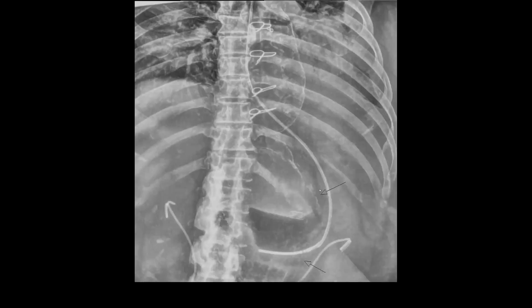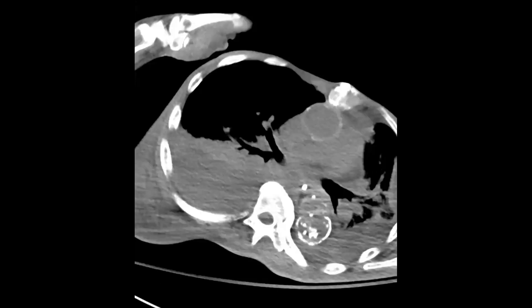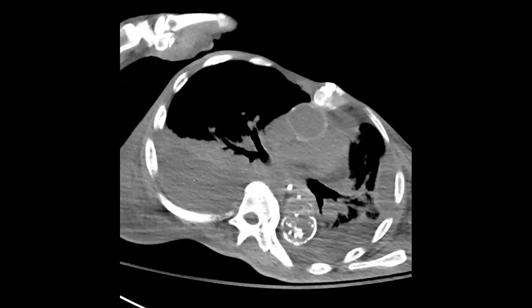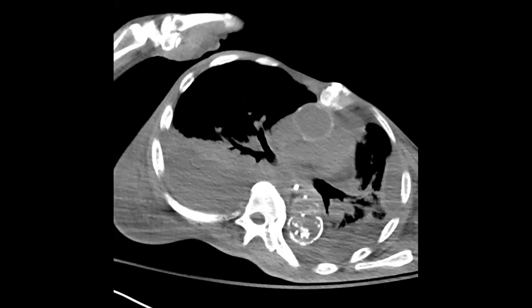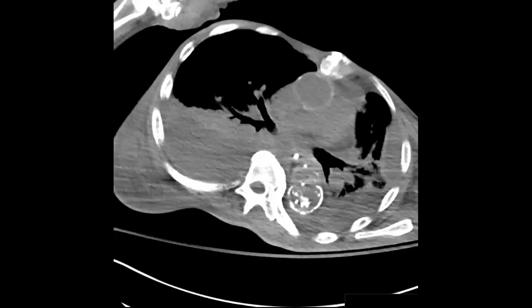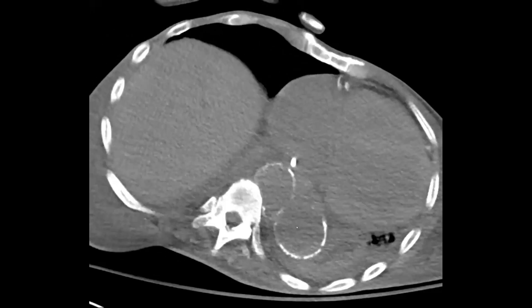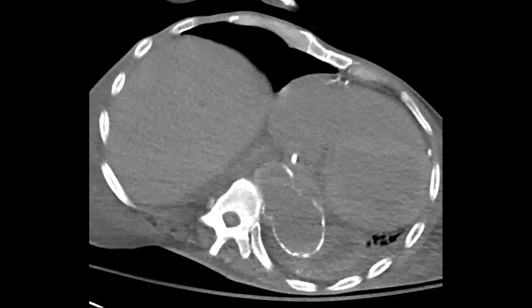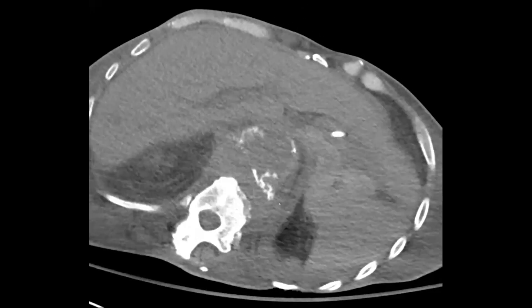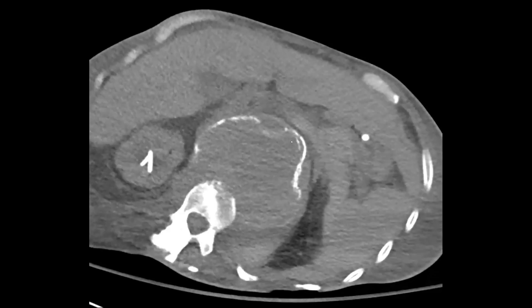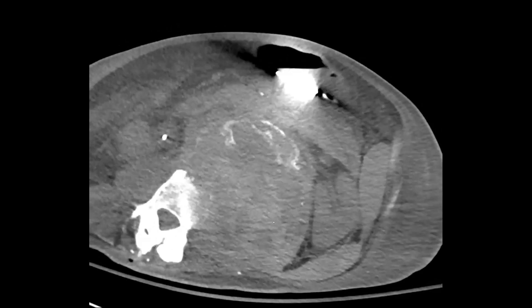One of my astute colleagues on this more contrasty algorithm noticed there are even calcifications more laterally. They said this looks like a new finding — all of these deviated calcifications — and recommended a CT. They did a CT, and as we go down, we can see the aorta is very, very ectatic. There was a dissection, and actually it had ruptured. Those displaced calcifications were a sign of the rupture.